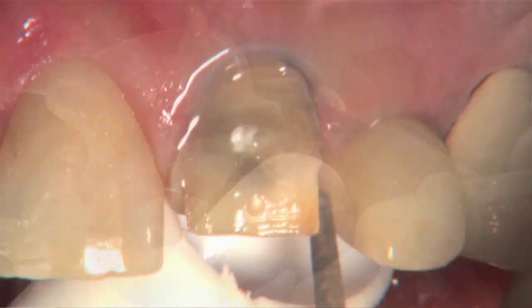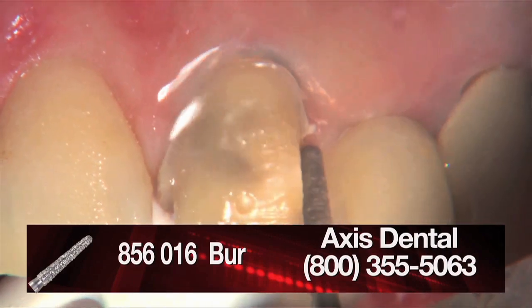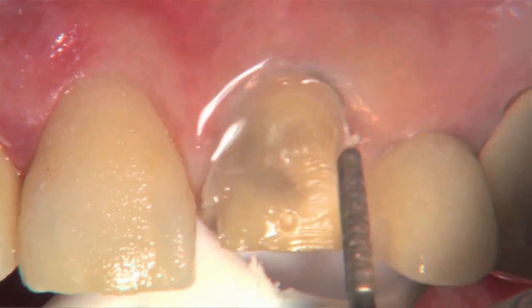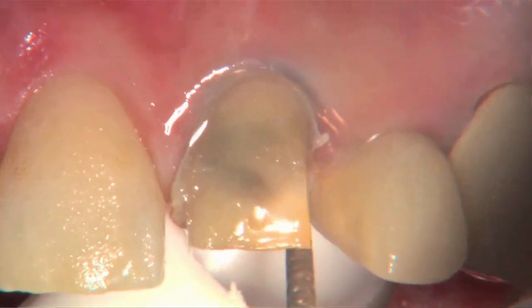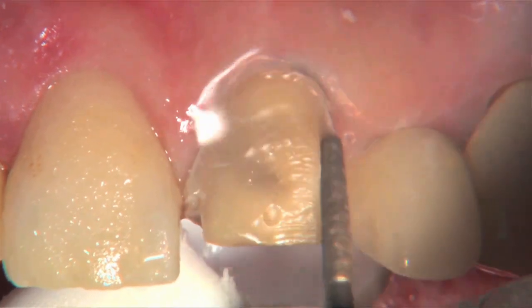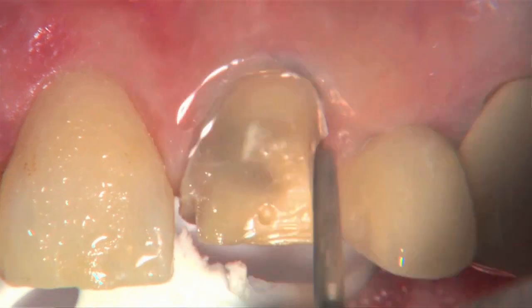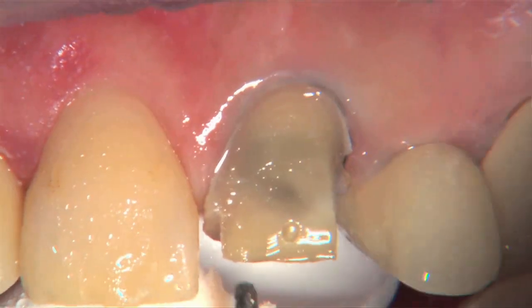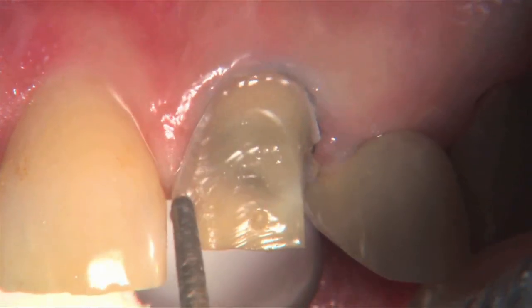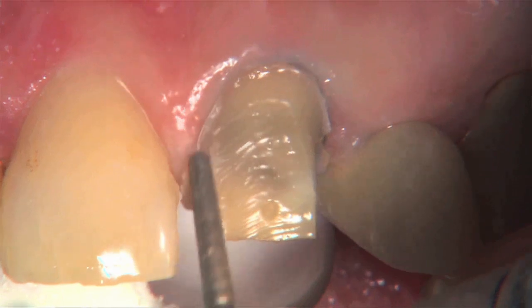As we head in approximately, I mentioned we're going to use the smaller burr. This is the 856-016 burr, and the 025 wouldn't quite fit in there right now without hitting the adjacent teeth. In fact, anytime you see an anterior preparation like this that's over-tapered on the mesial and distal, it's a pretty good sign that the dentist who prepped it went in with too large of a burr and had to over-lean the burr towards the inside of the tooth and over-prepped it, trying to avoid the tooth next to it. And that can be avoided with this 856-016 burr because it'll fit between any two sets of teeth.